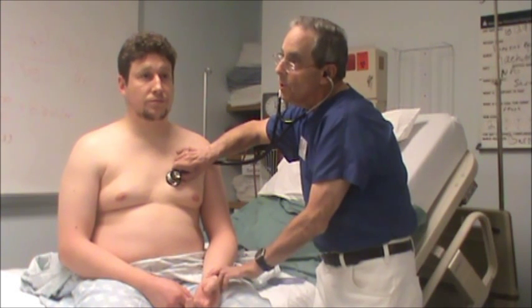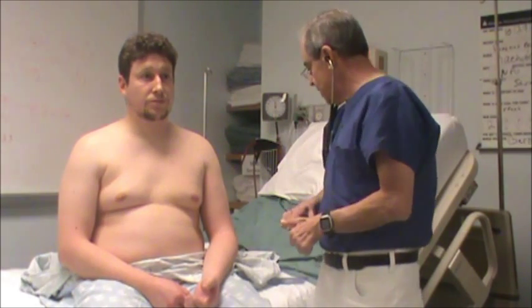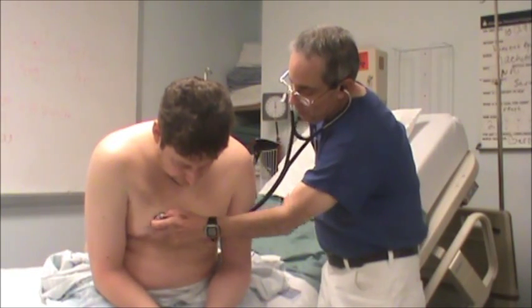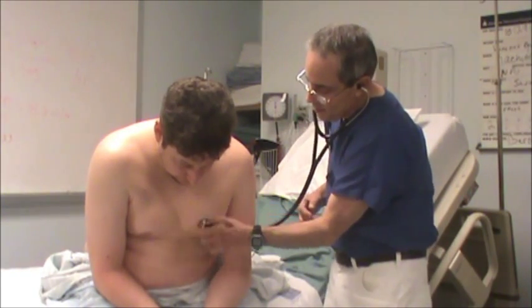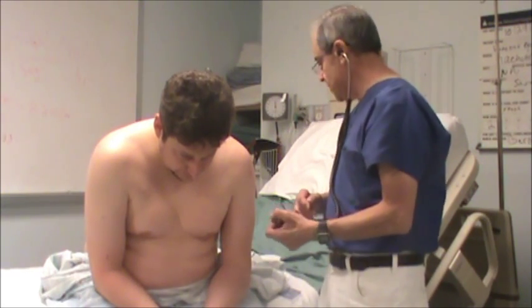You should feel a pulse for every apical heartbeat that you hear. After you completed your pulse deficit, do your auscultation with the patient leaning forward. So can you lean forward? And you would, once again, do your 4 areas of the heart with the diaphragm and then with the bell.